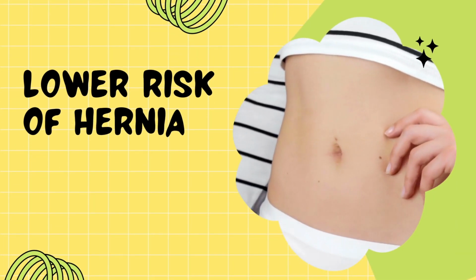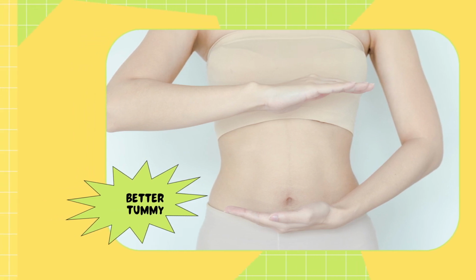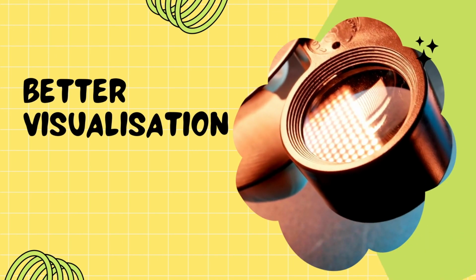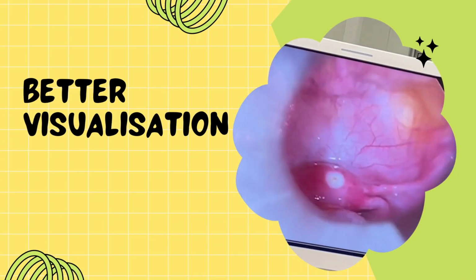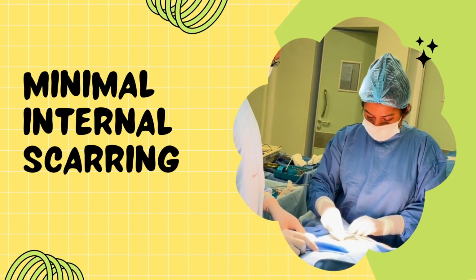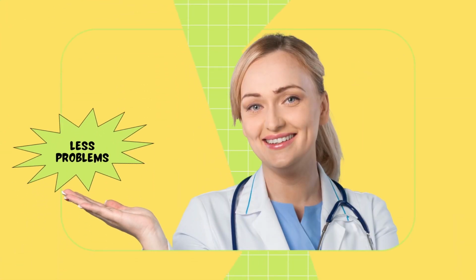Lower risk of hernias. The risk of incisional hernias occurring at the surgical site is reduced due to the smaller incisions. Better visualization. Laparoscopic cameras provide magnified, high-definition views of the surgical area, allowing for precise and detailed work. Minimal internal scarring. Laparoscopic surgery minimizes internal scarring, which can be a concern with open surgery and may lead to complications in the long term.